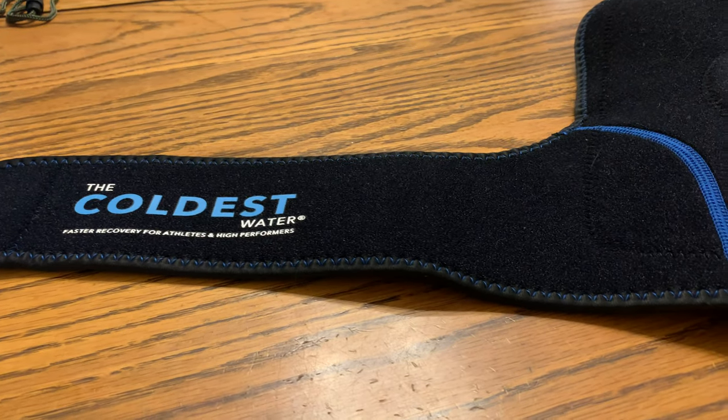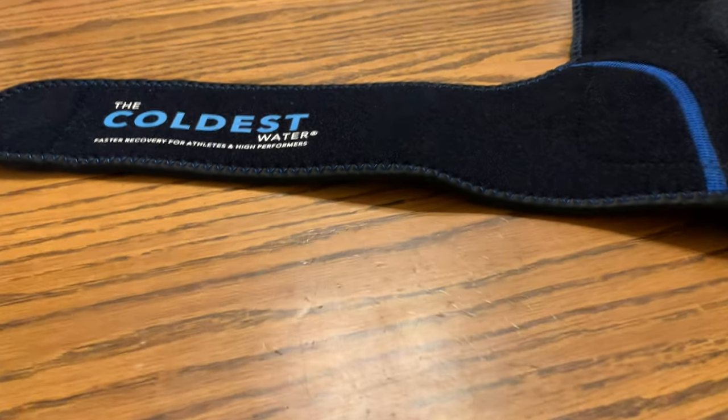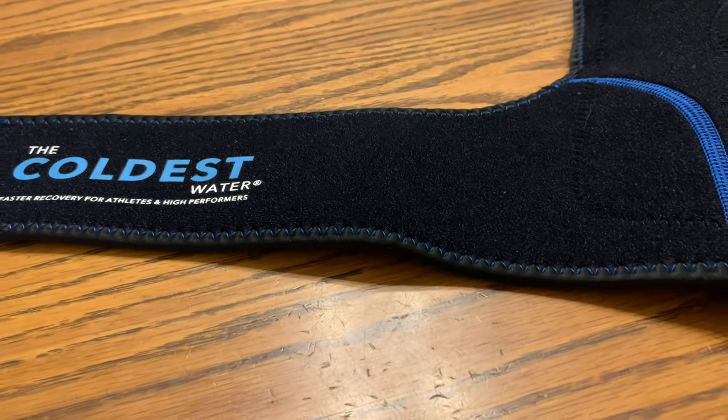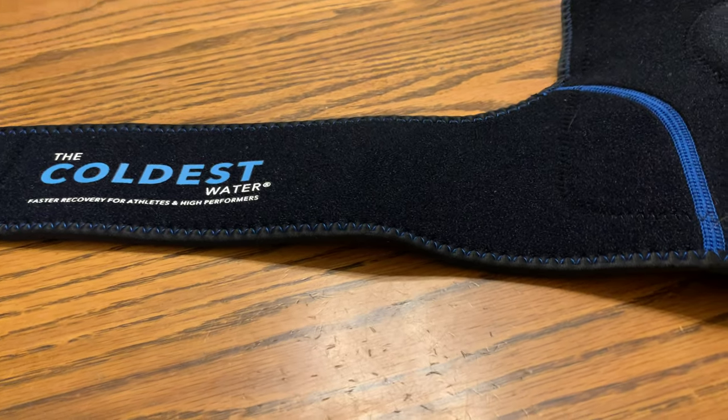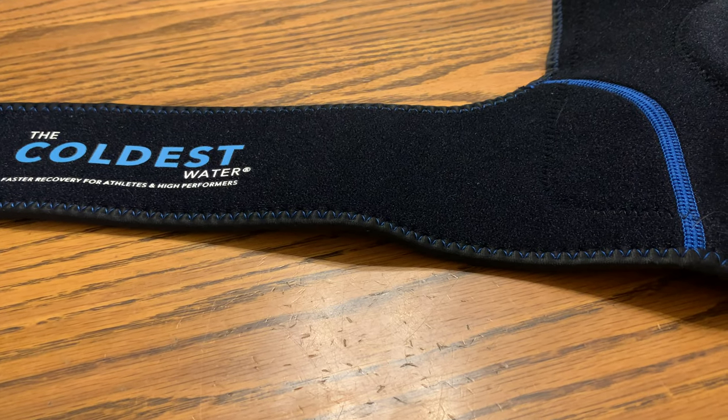Hey guys, today we're taking a look at the Coldest Knee Ice Wrap. This is great if you have swelling of the knees or arthritis in your knees. It keeps the pain down.